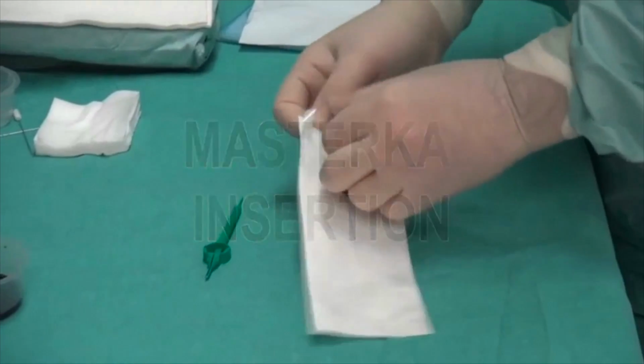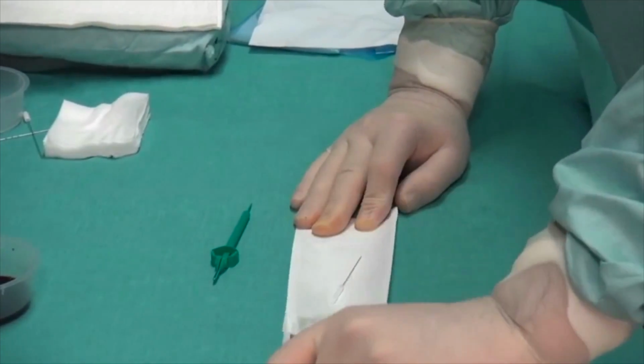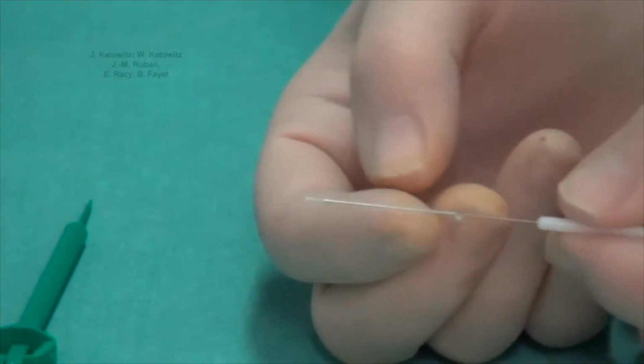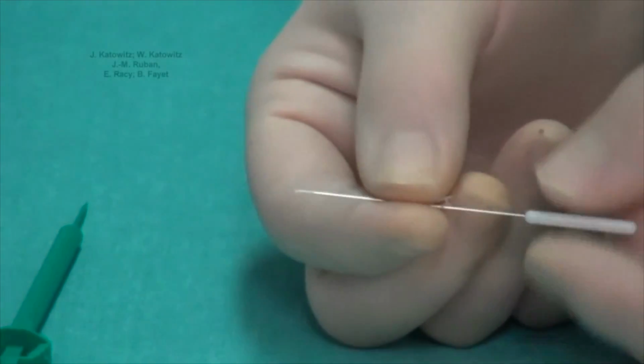The entire surgical zone can be cleaned with a diluted betadine or a chlorhexidine solution. The appropriate sized MASTERKA is then removed from its sterile package. It should be determined that there is easy movement of the metal insertion guide within the lumen of the silicone sleeve.